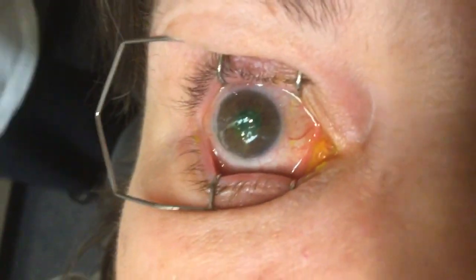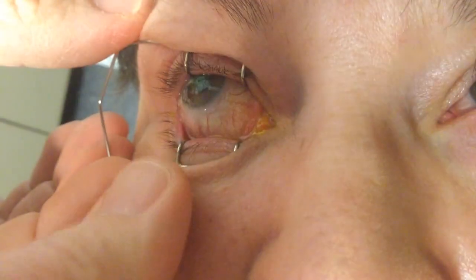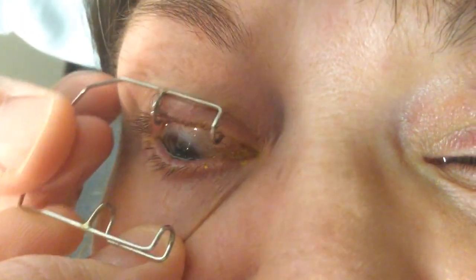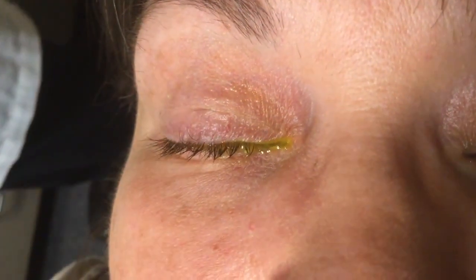I'm going to take that little lid separator off now, okay? Look up. Down. Close your eye. Keep it closed. You did great.